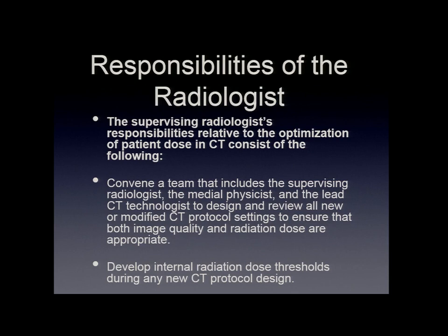The ACR is an organization of radiologists. They're really the lead interpreting member of the team. They're actually reading diagnostic studies that need to be valid. So they need to make sure that there's a program that's effective, that's guaranteeing that their images are clinically relevant, and that they're minimizing artifacts and other things that can interfere with clinical interpretation. So the supervising radiologist is responsible overall to see that there's an optimization of dose and image quality.